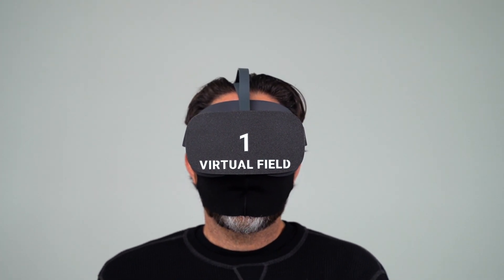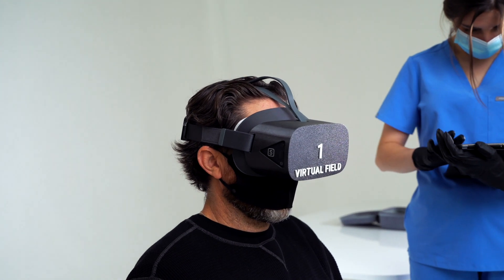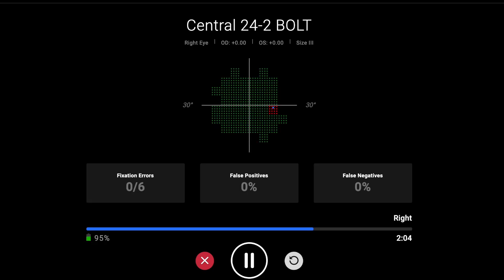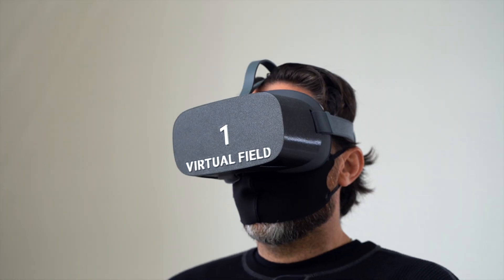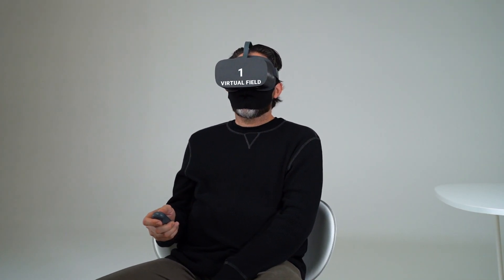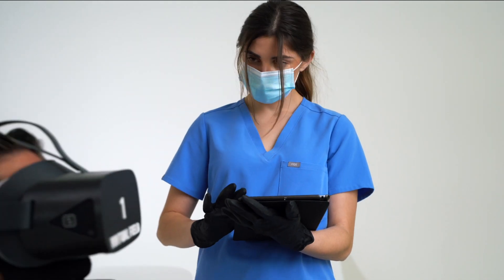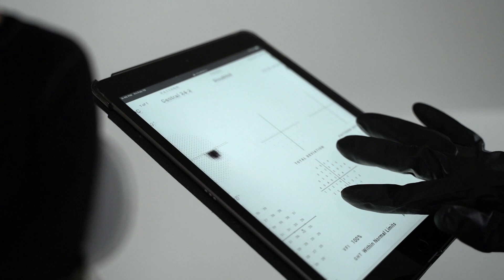One setup step is not required: wearing an eye patch. Virtual Field is a monocular test, but occlusion is handled by our software. The exam takes three to five minutes per eye for BOLT, our fast thresholding algorithm, or one to two minutes per eye for a screening exam. Fixation losses, false positives, and false negatives are monitored by our software.